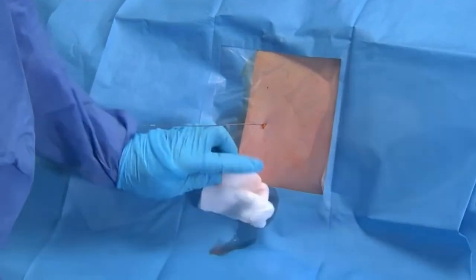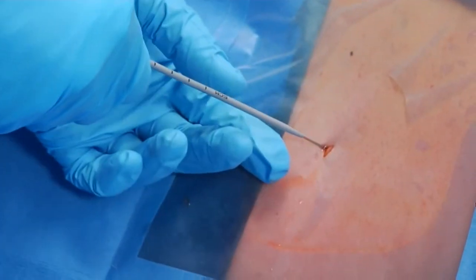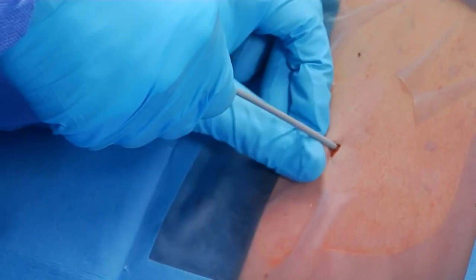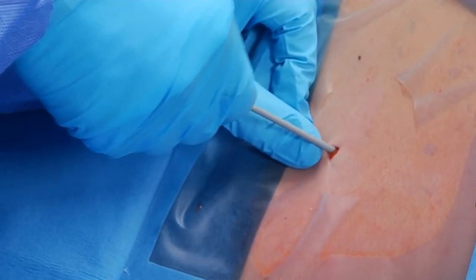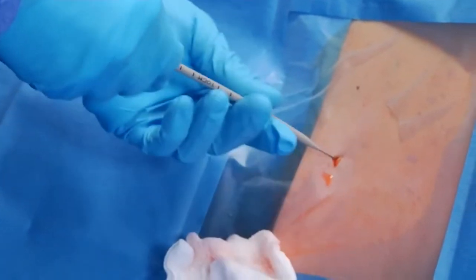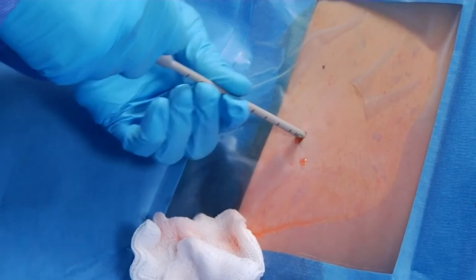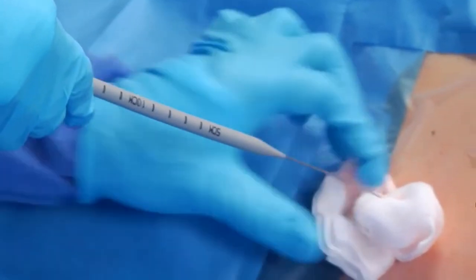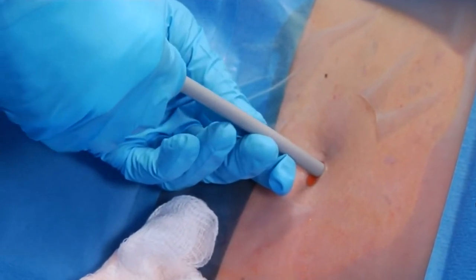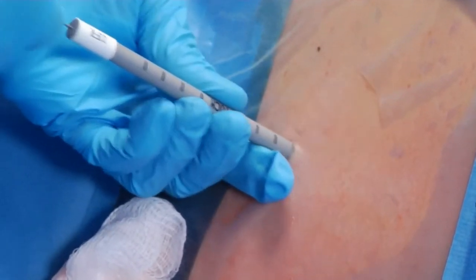While maintaining the wire guide position, dilate the tract and opening into the pleural space by advancing, in sequence, small to large, the supplied dilators over the wire guide. Introduction into the pleural space is facilitated by rotating and advancing the dilators in line with the wire guide to prevent its kinking. Over-insertion of the needle and/or dilators may result in serious harm to the patient. It is important to have enough length of wire guide exiting the access site to facilitate controlled introduction of the dilators. The dilators only have to enter the pleural space to their full diameter and should never be advanced beyond the distal end of the wire guide.